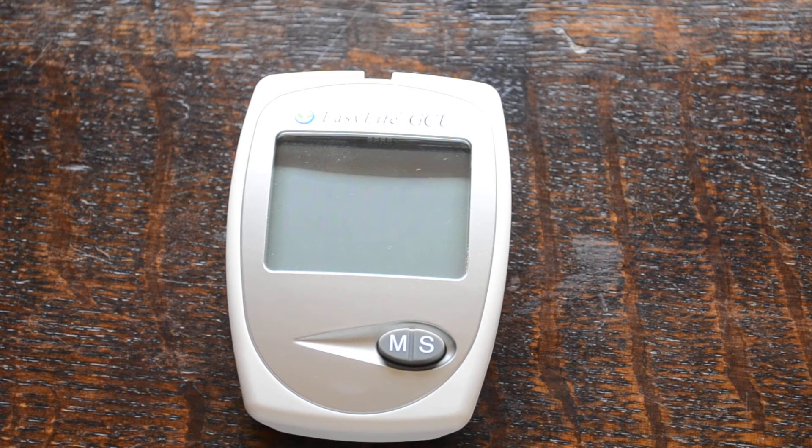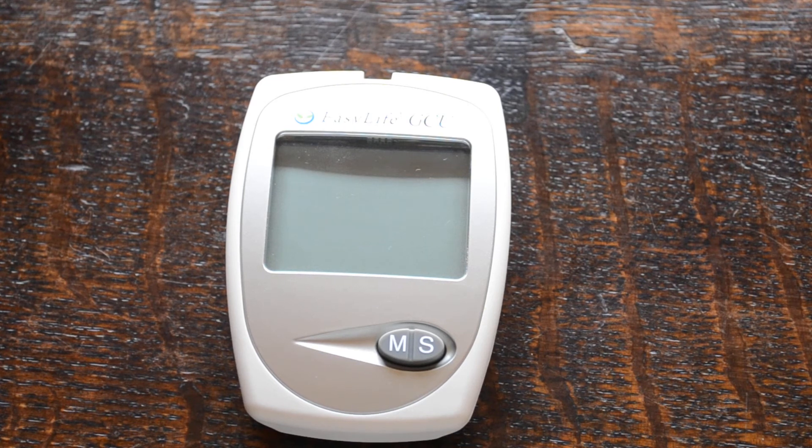It is important to set the time and date before you start testing, because without the time and date set the memory function can't work — the memory recall doesn't log your results with time and dates. If you're going to do a series of tests, particularly cholesterol or glucose, it's very useful having the memory function on these meters where you can recall previous results with times and dates, and see the emerging pattern of treatment or diet manipulation.